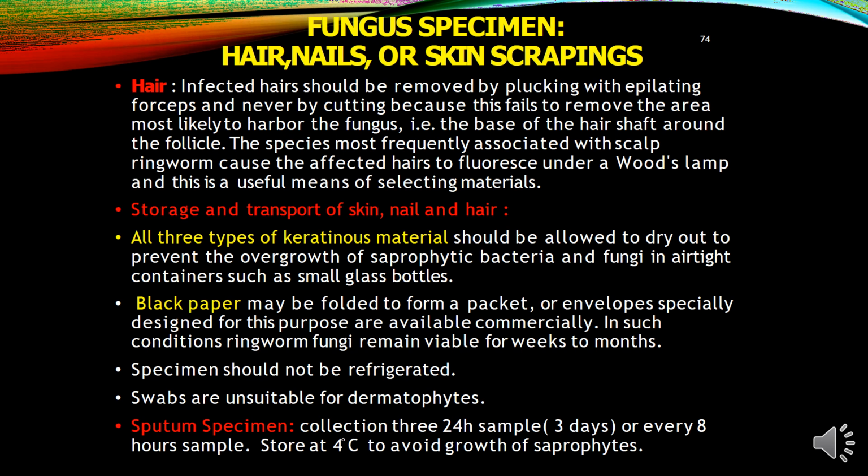Fungal specimens. For hair, nails, and skin scrapings, hair: infected hair should be removed by plucking or using epilating forceps and never be cut, because cutting fails to remove the area most likely to harbor the fungus, that is the base of the hair shaft around the follicle. The specimens collected contain species more frequently associated with scalp ringworm, causing the affected hair to fluoresce under a Wood's lamp.